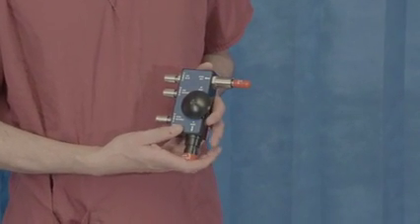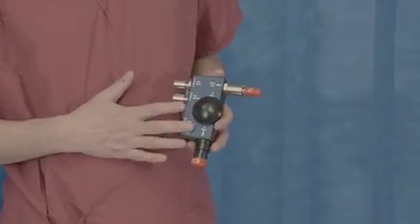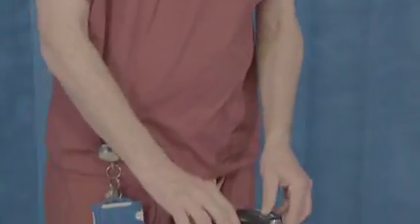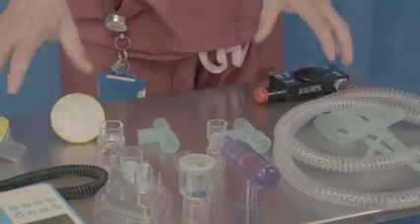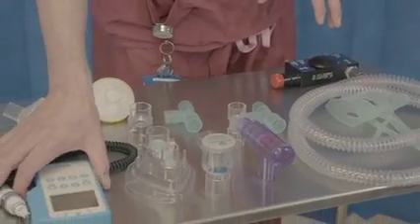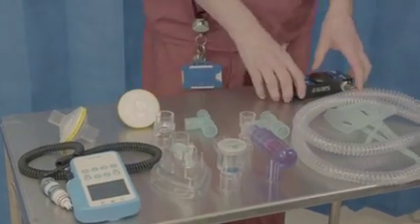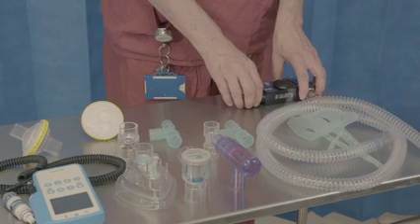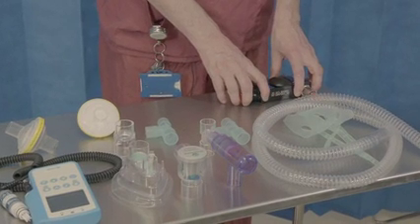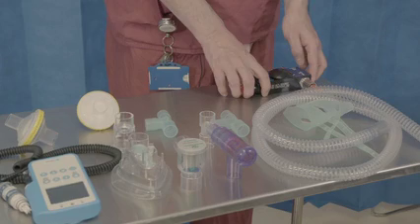The system is essentially composed of three main parts: the flow generator, the disposable circuit, and this reusable oxygen analyzer. It's important to note that some components of the circuit and the oxygen analyzer can look different at times, but should all fit together in the same way, just as the instructions in the box would suggest.